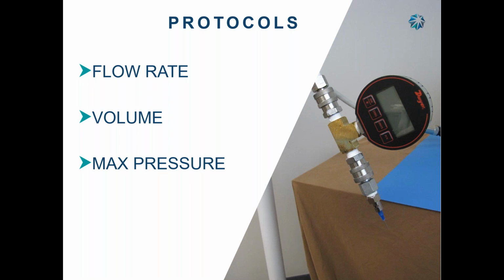CT injectors will go up to 325. Cath labs will go up to 1200 PSI. It's a lot of pressure, right? So why do we set a max pressure? What don't we want to do? Actually, no. It has basically nothing to do with patient safety.